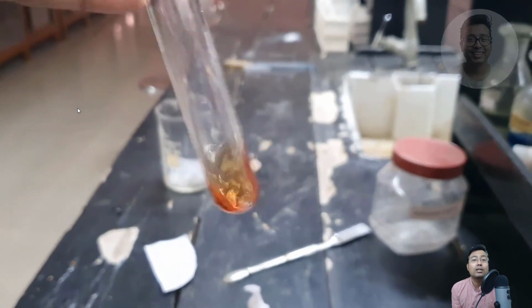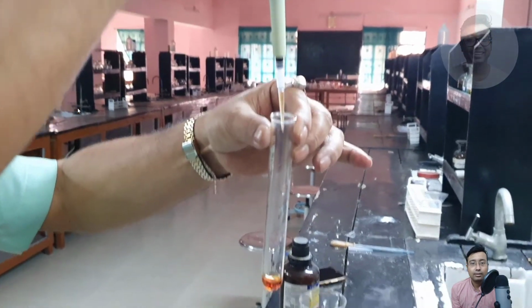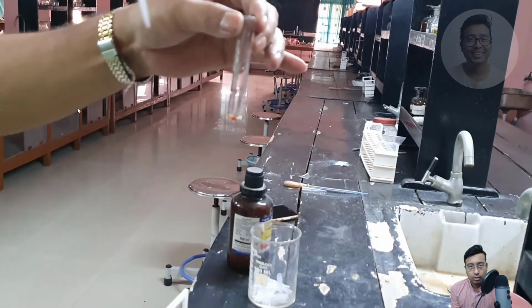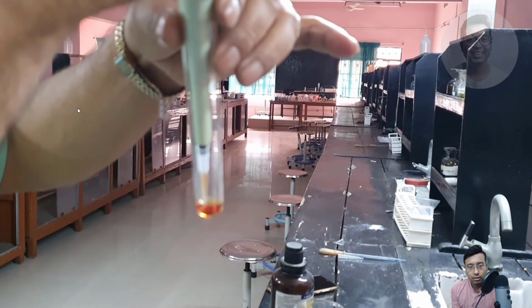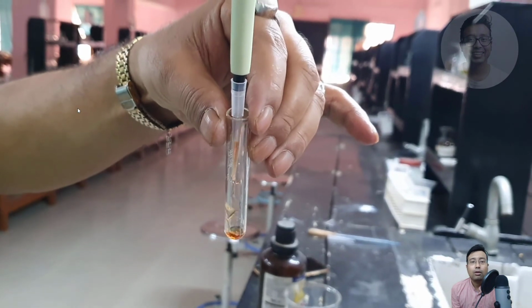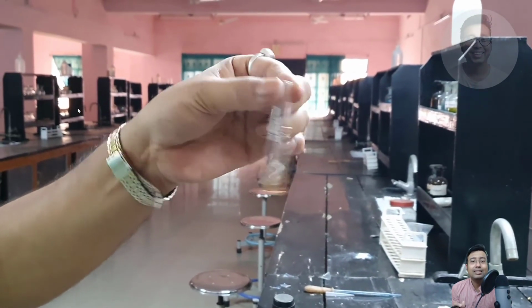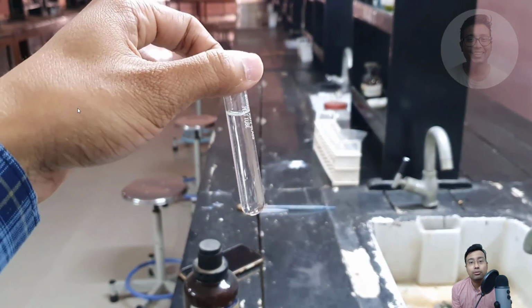Right, so now this is the ammoniacal solution of sodium nitroprusside that is ready. Next we need to dilute this ammoniacal solution of sodium nitroprusside with 10 parts of water. So over here we'll be taking 200 microliter of this ammoniacal solution, and to it we'll add 2 milliliter of water. As you can see, the amount can vary, but this is what I found to illustrate the best possible color.